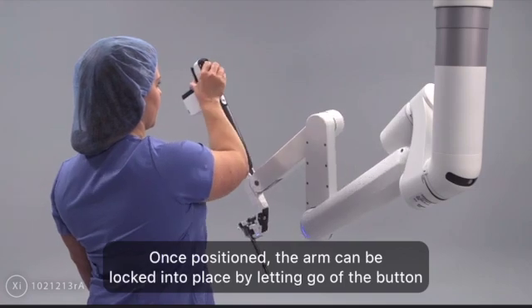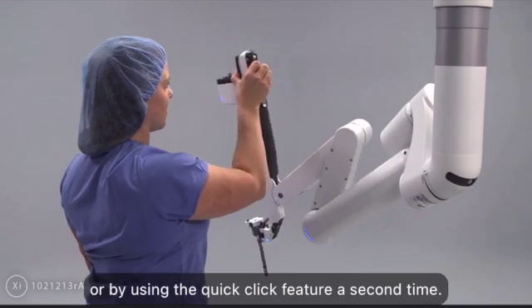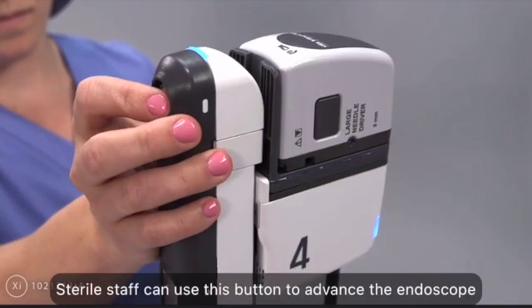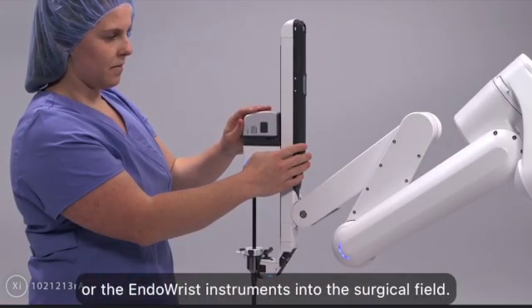Once positioned, the arm can be locked into place by letting go of the button or by using the quick click feature a second time. Sterile staff can use this button to advance the endoscope or the EndoWrist instruments into the surgical field.